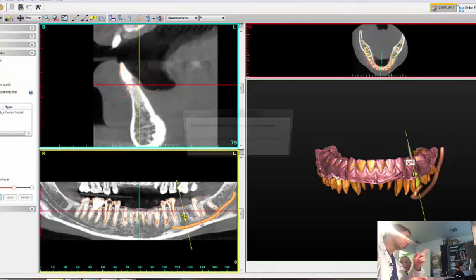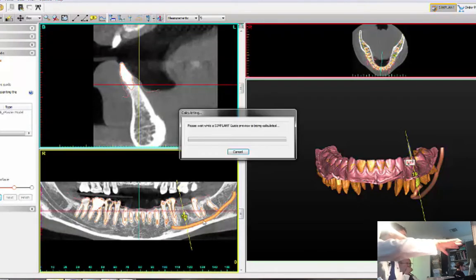So there are a couple of things to check for the guide. With people actually now, at this point, they just pay for it and then forget about the whole thing. But you don't have to create the contours of the guide. You don't have to create the guide tubes. You'll see. You don't have that much control here. Okay. So that takes a few minutes.